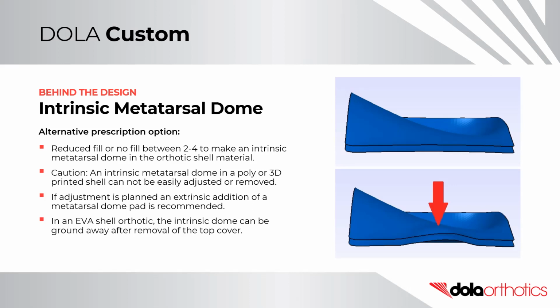Caution: an intrinsic metatarsal dome in a poly or 3D printed shell cannot be easily adjusted or removed. If you plan for adjustment, please use an extrinsic addition of a metatarsal dome pad. In an EVA shell, the intrinsic dome can be ground away after removal of the top cover.